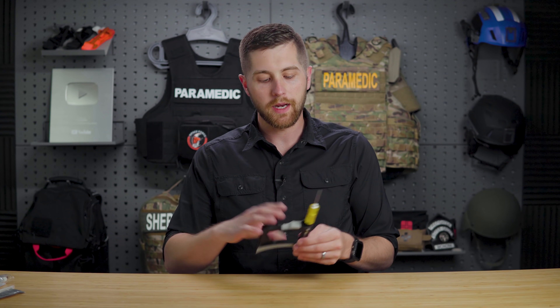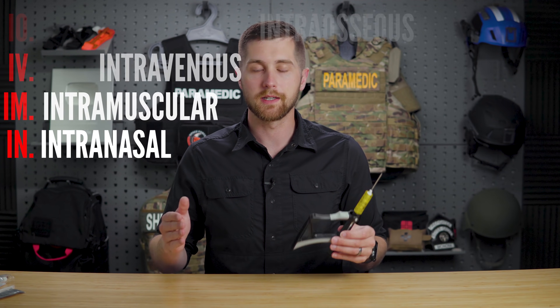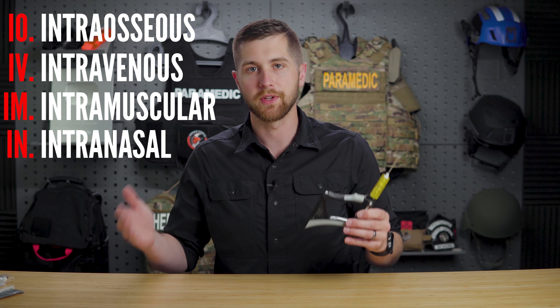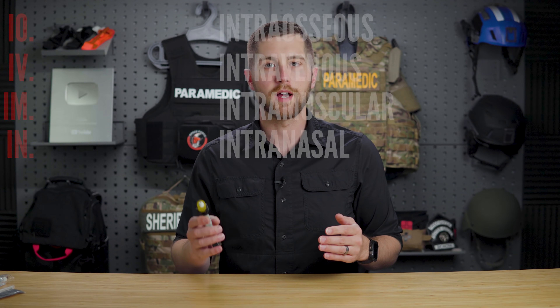What exactly is an IO? An IO stands for intraosseous, similar to IV standing for intravenous. This is simply a way for us to give medications to a patient when we cannot establish an IV in a rapid amount of time. Any medication that can be given IV can be given through an IO, which is kind of neat.